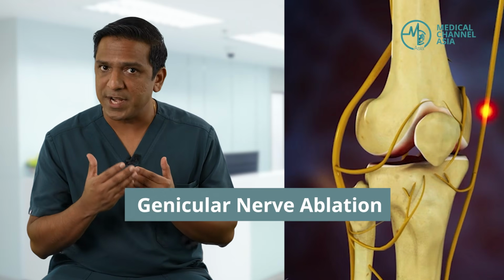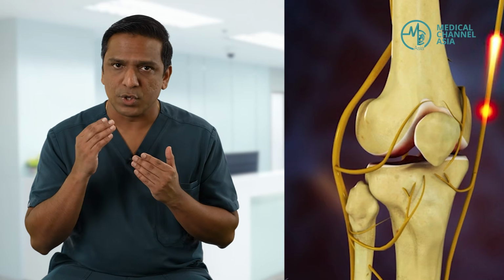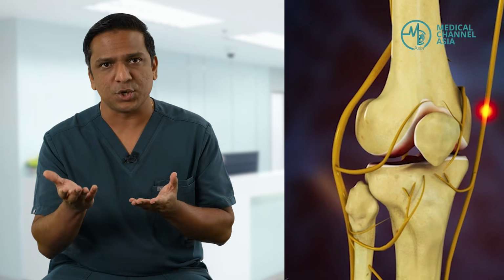Now, the pain generators in his knees are the genicular nerves. So we targeted the genicular nerves using genicular nerve ablation, radiofrequency ablation, to reduce the pain coming from his knee joint. So genicular nerve ablation involves the treatment of burning the nerves of the knee joint.